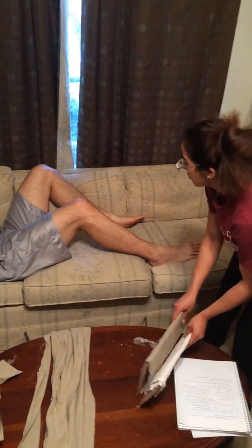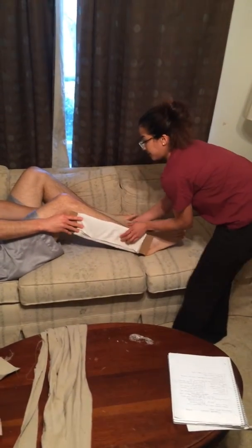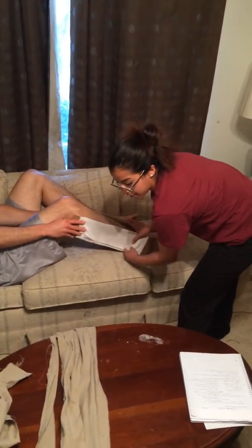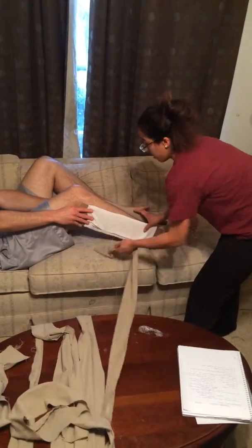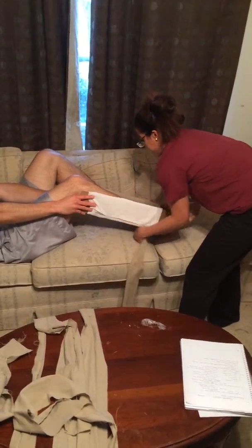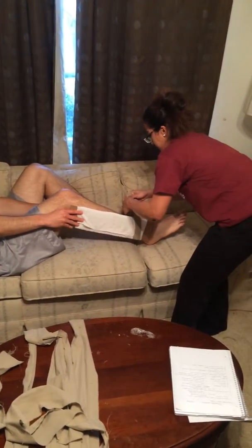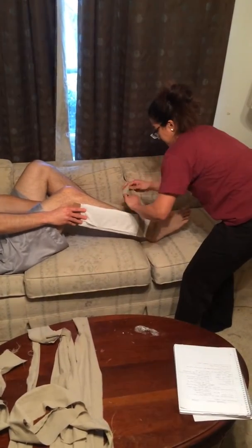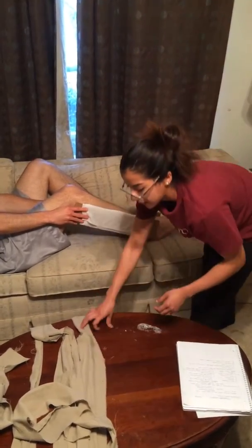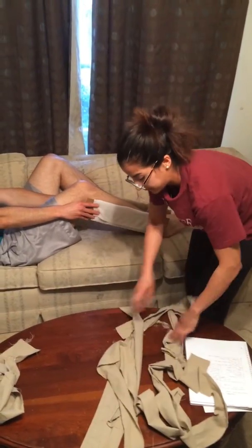Next I will get my splints and I will position them. Then I will tie the first binder around the ankle area. And now I will work my way up.